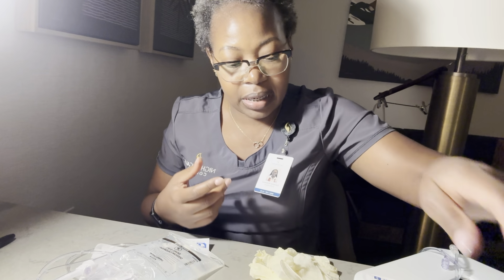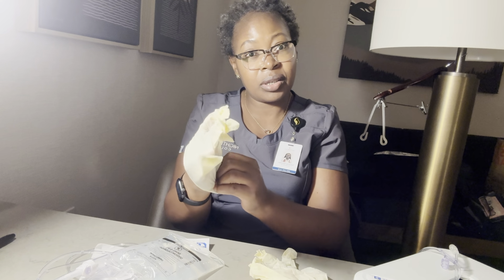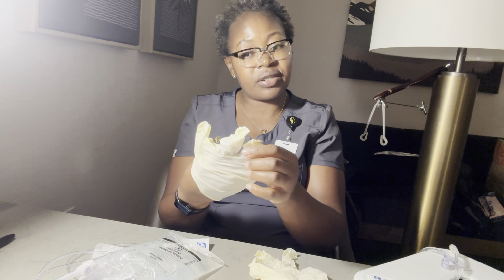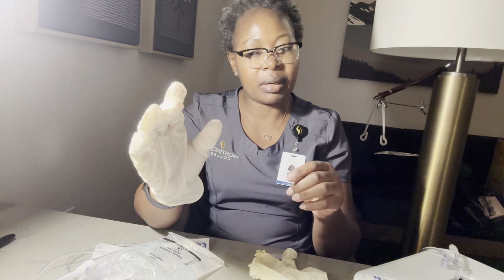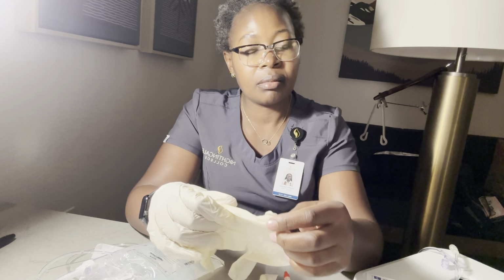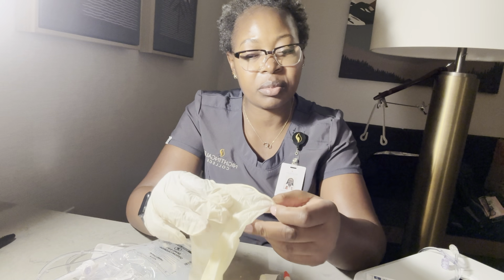So I'll go ahead and confirm the six rights of medication administration, which is the right patient, right drug, right dose, right time, right route, right documentation.